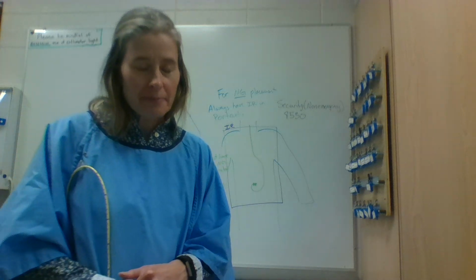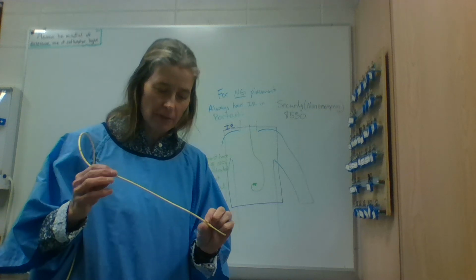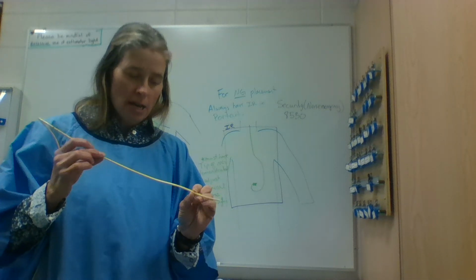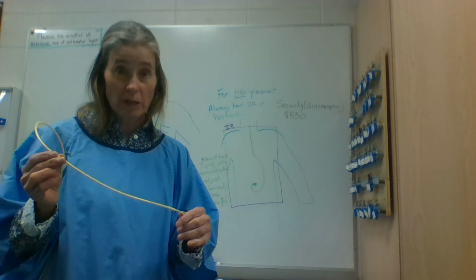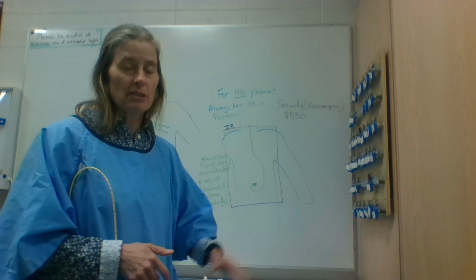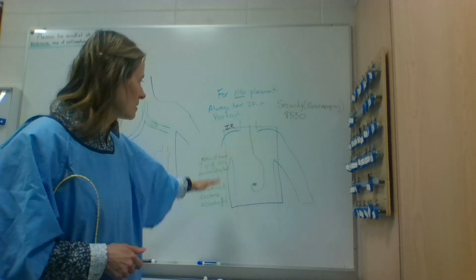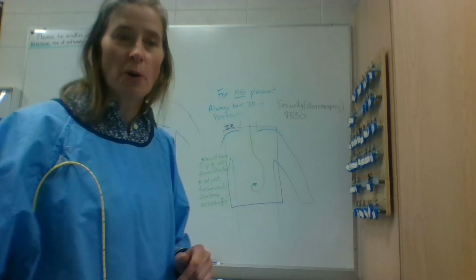Other than that, these will come in a few different sizes and shapes, based on the patient. Pediatrics would obviously be quite different. But please, from our perspective, make sure you consider those adjustments that we are required to do. Okay, thank you.